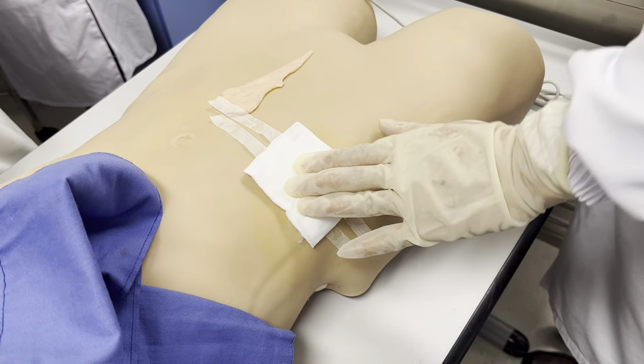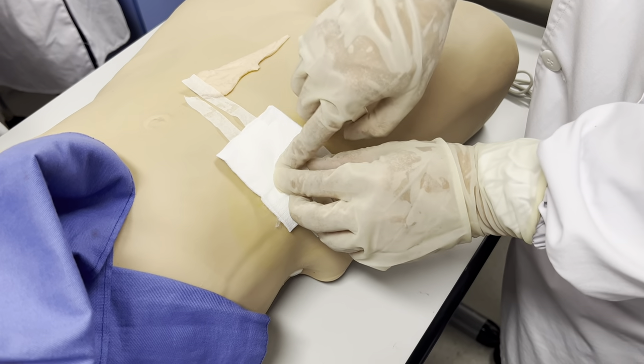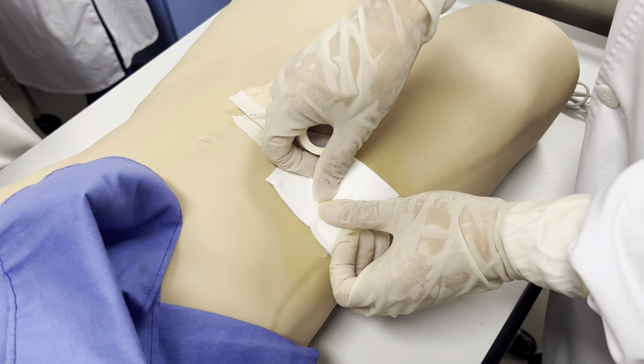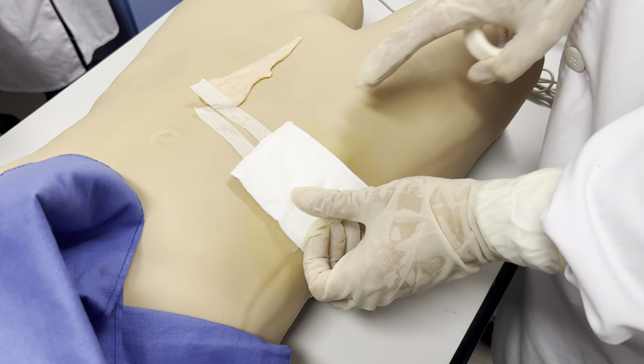If the patient has a large amount of ascites, they have pressure. We also use a cap — cover here, cover here — and fix it. And we can avoid the leak of ascites.